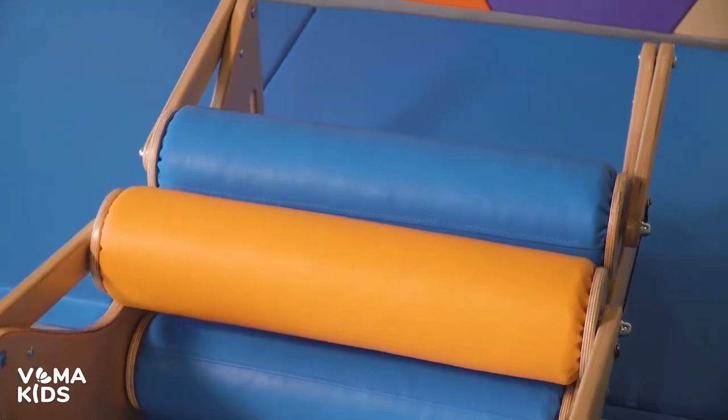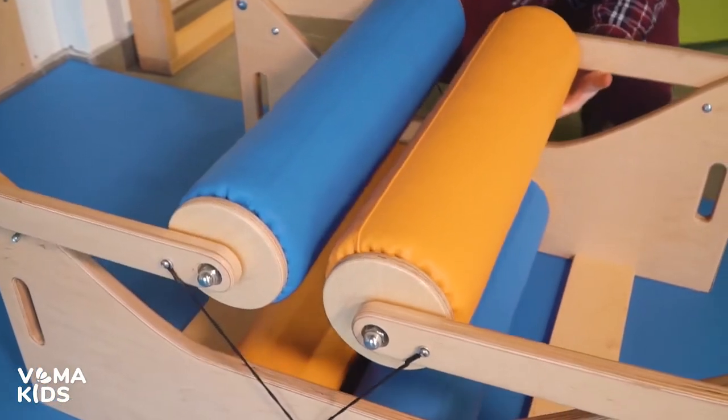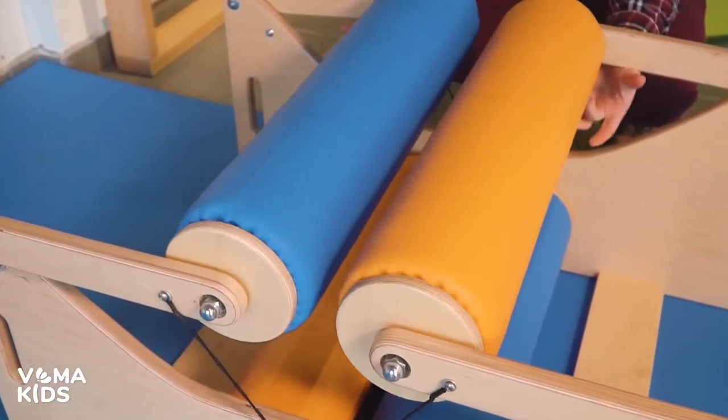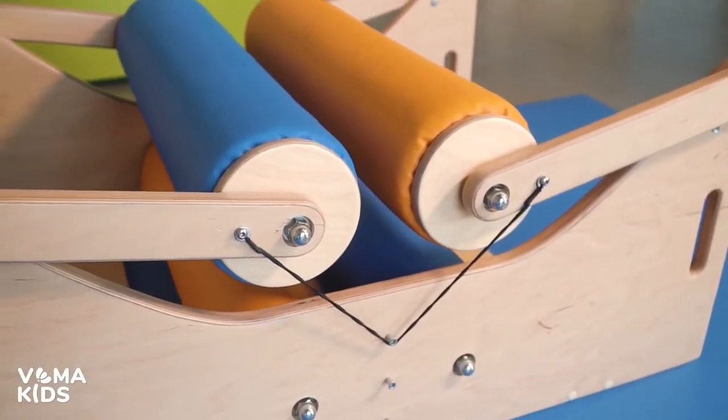The equipment consists of a base with two pairs of rollers. The rollers are soft and elastic. They have bright colors and a smooth surface, which makes it very easy to keep an eye on the equipment.